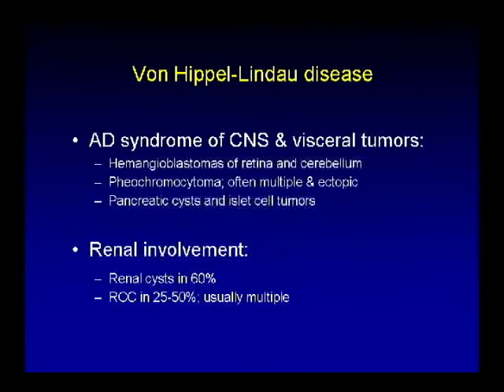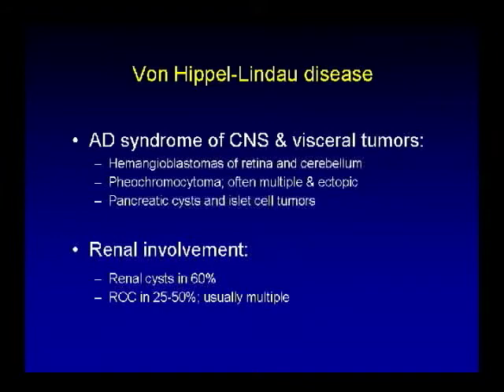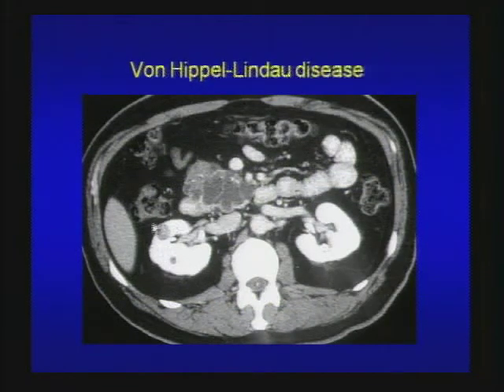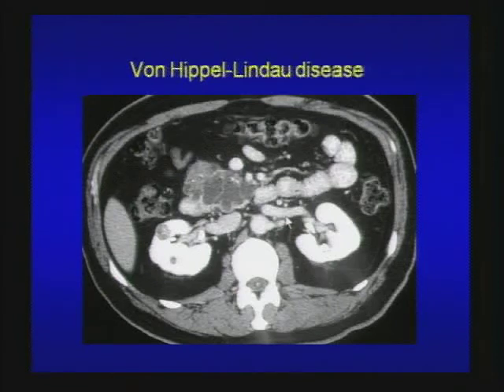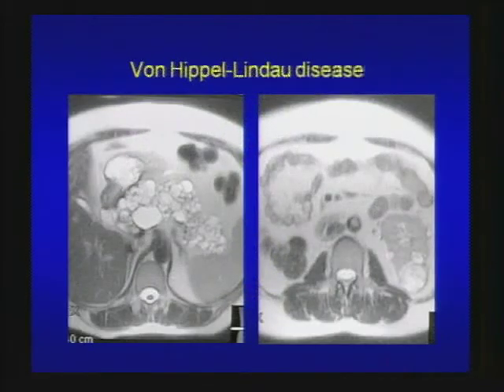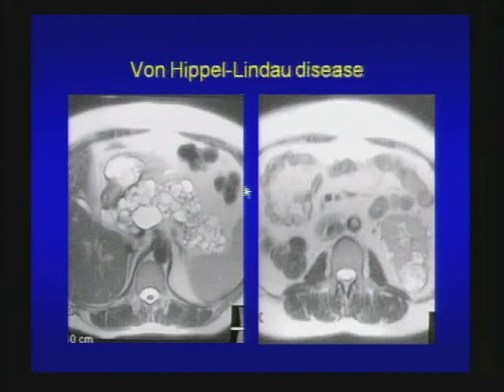Von Hippel-Lindau disease is another autosomal dominant syndrome of CNS and visceral tumors. It consists of hemangioblastomas of the retina and cerebellum, pheochromocytomas which are often multiple and ectopic, pancreatic cysts, and islet cell tumors. In terms of renal involvement, renal cysts are frequently seen, but more importantly renal cell carcinoma occurs in 25% to 50% and is usually multiple. Here's a case of a solid enhancing right renal mass consistent with RCC and multiple cysts in the pancreas — Von Hippel-Lindau disease on oral boards. This is the answer to unknown case number two.